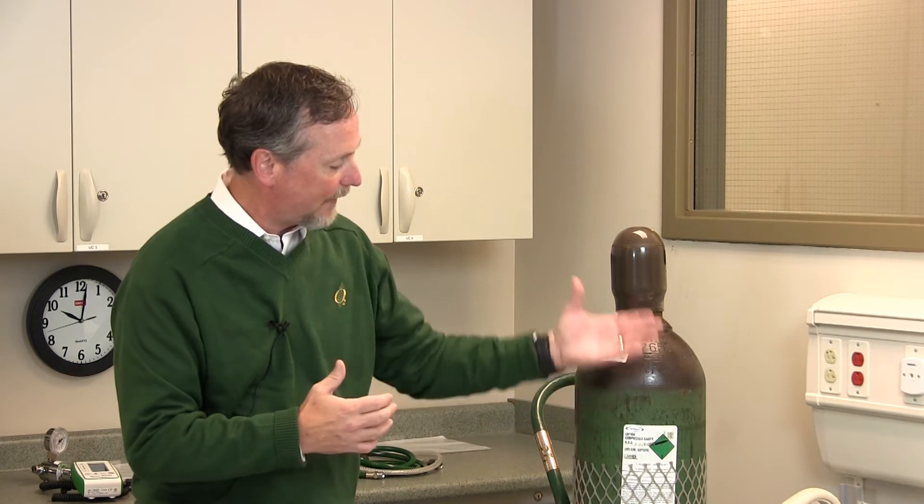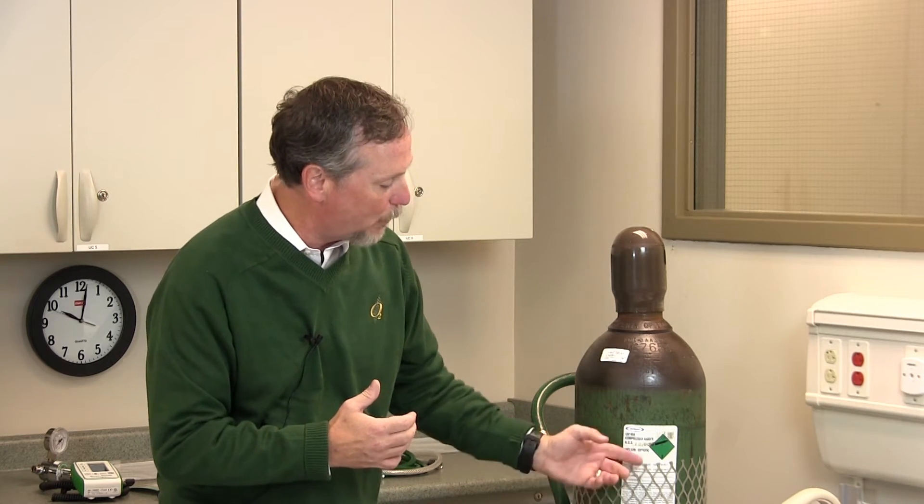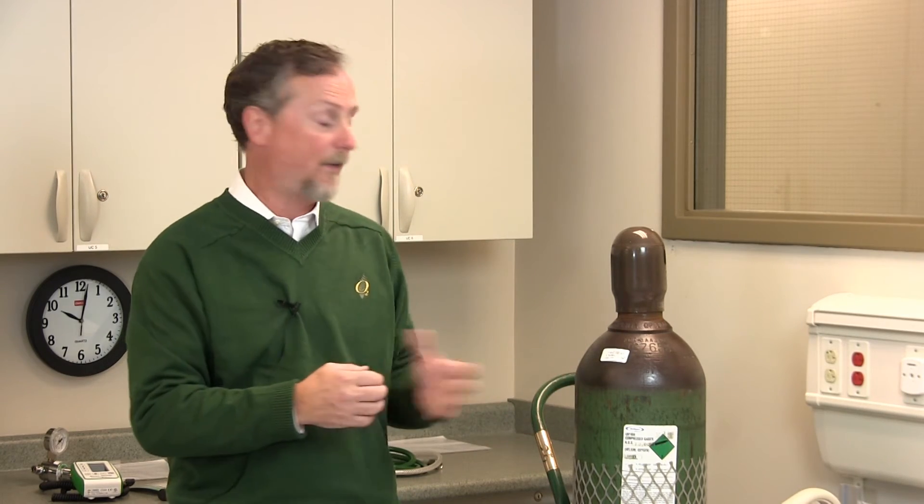So medical Heliox — looking at the tank — the really important thing is this tank will often be labeled with its concentration. It's very important at the very beginning, maybe when the tank is first being used and opened, that you analyze the contents of the tank. Heliox and oxygen are put into these cylinders, and the cylinders are spun to homogenize or mix the contents of the cylinder.